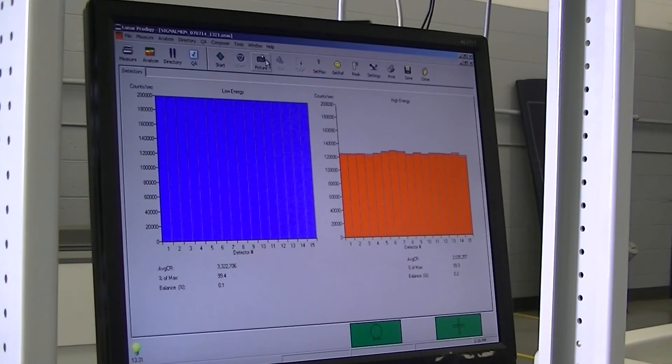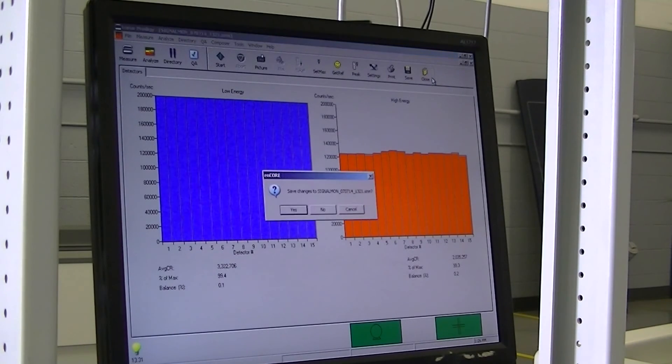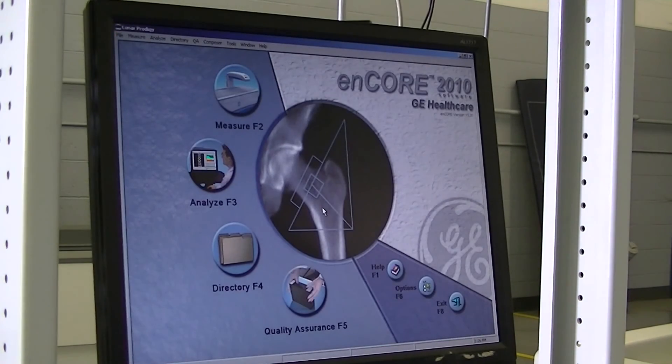The next test after signal monitor will be beam wobble. Beam wobble will check the level of the table. You always want to make sure the table is level so the x-ray is stable. So from here, we'll go to Measure.